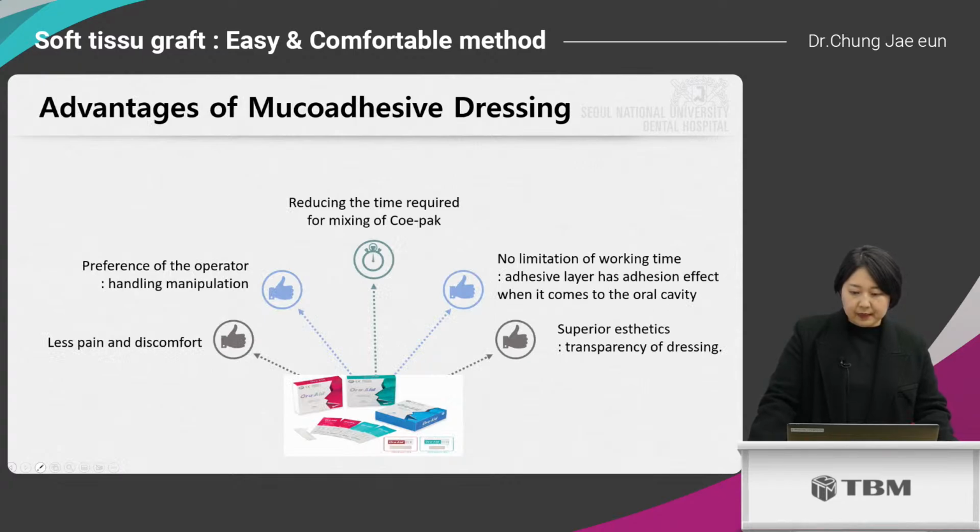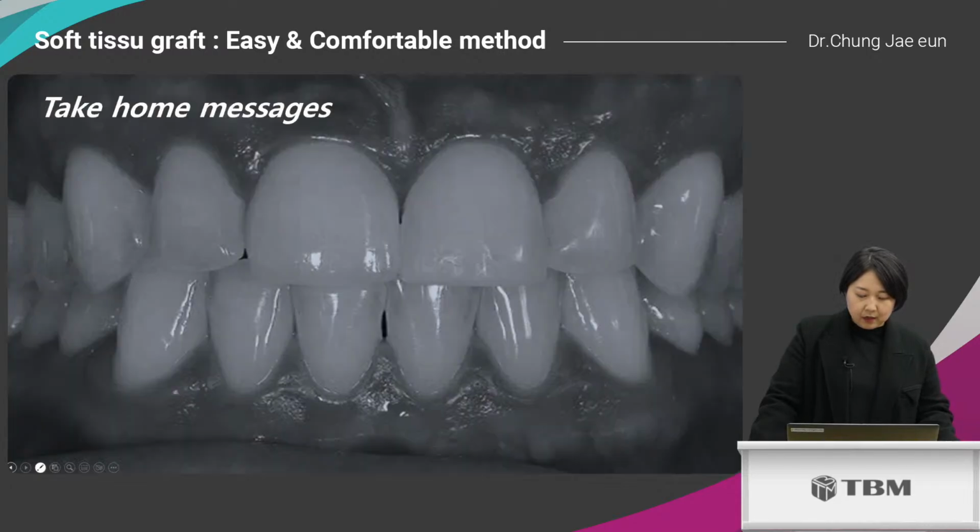As we confirmed in this research, the advantages of mucoadhesive dressing are less pain and discomfort, less required time, no limitation of working time, and superior aesthetics. Okay, these are the take-home messages.